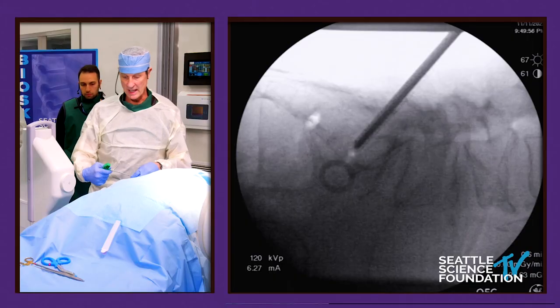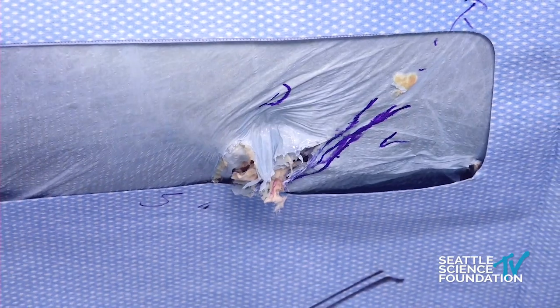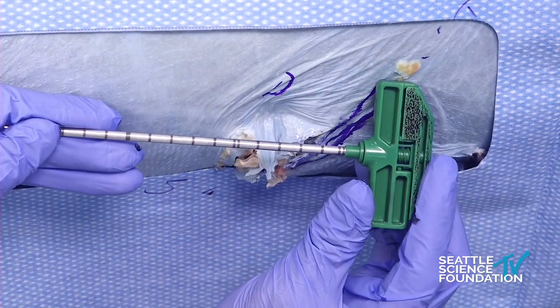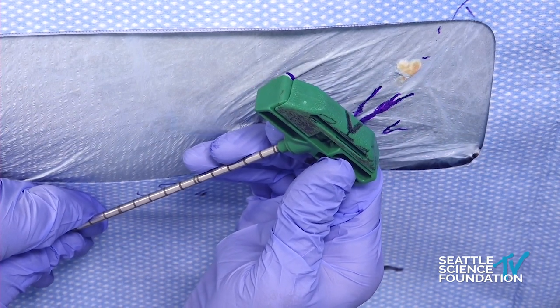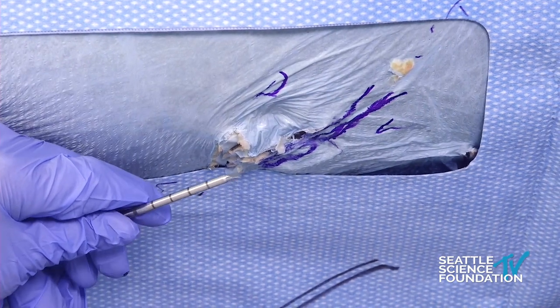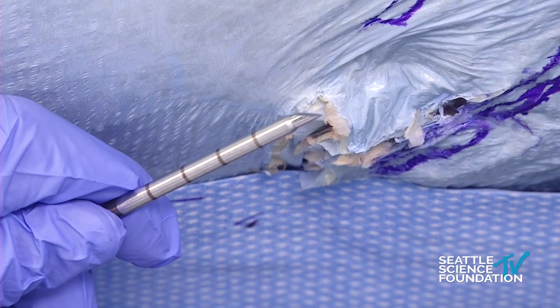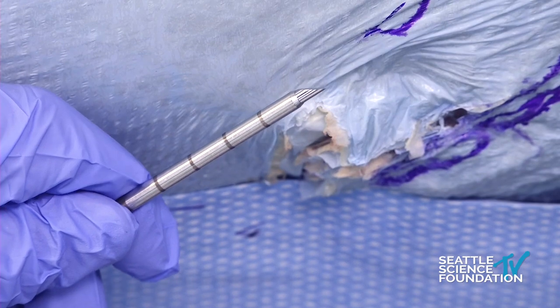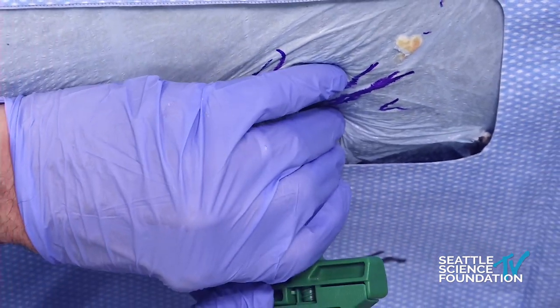We always start with the rigid access. The rigid access needle is here. We always put a mark on it for directionality, because this particular needle doesn't have a mark on directionality so we don't really know where it goes. This is a single bevel needle, as used previously for vertebral augmentation. There is also a diamond tip, but I like the directionality of the single bevel.